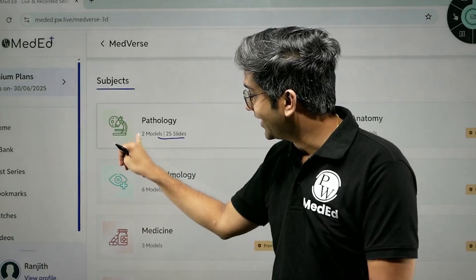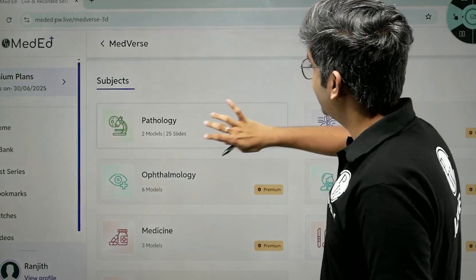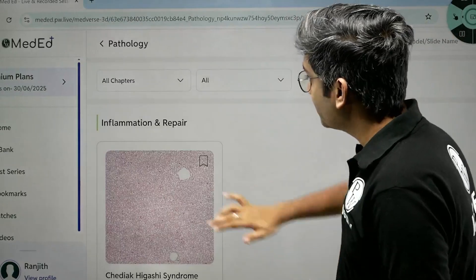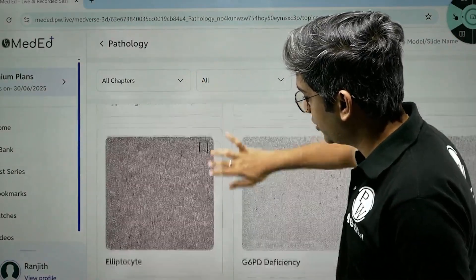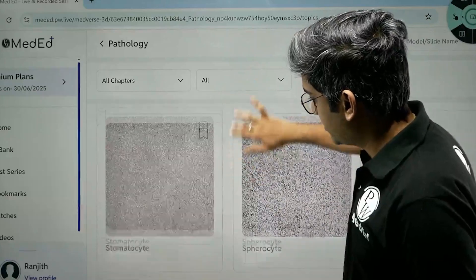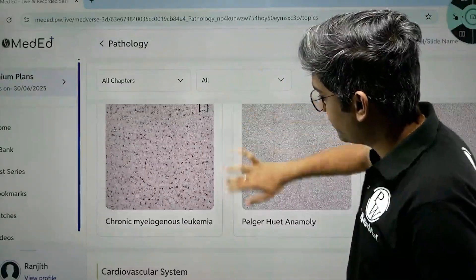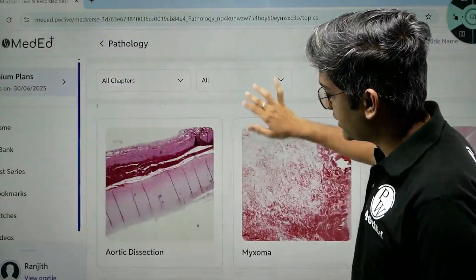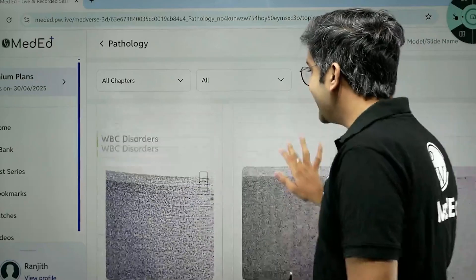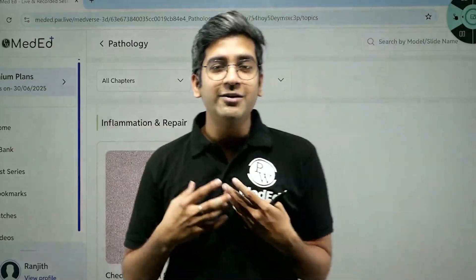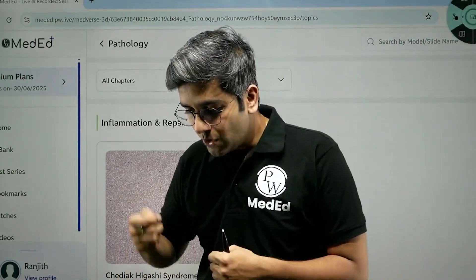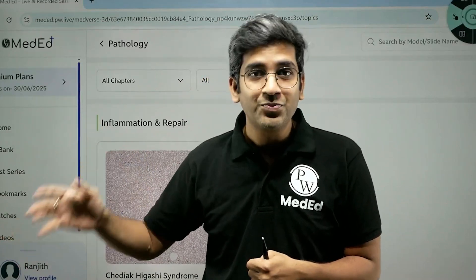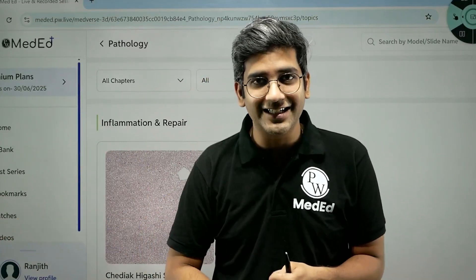Click on that and it will be categorized as inflammation, RBC disorders, WBC disorders, cardiovascular system, and more. The goal here is very simple: to give a very immersive learning experience — the same way you look into the microscope or your teacher shows you in real life — right in the palm of your hand.